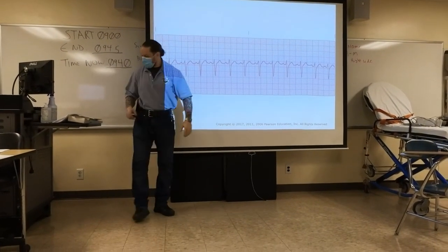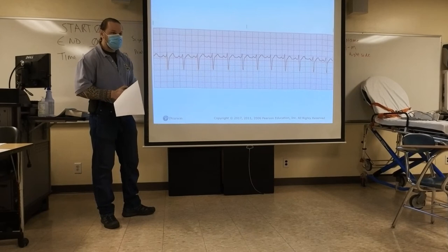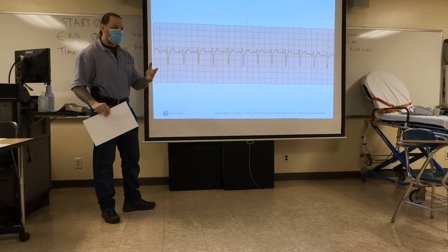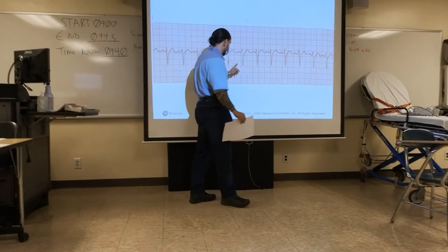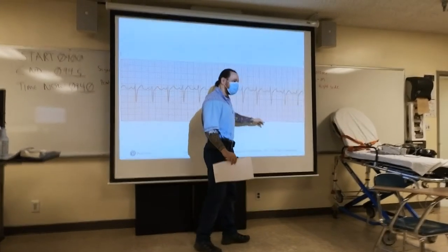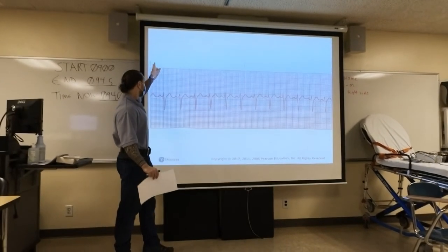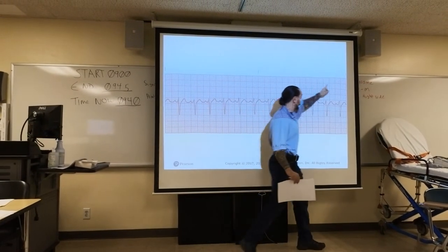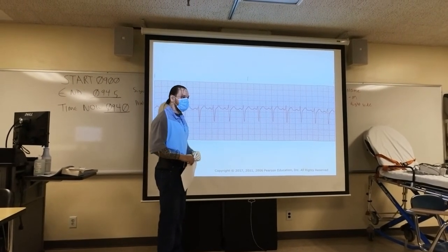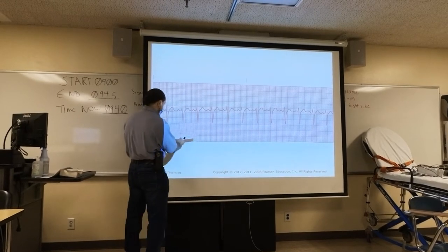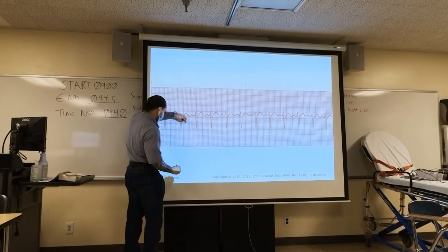I'll show you examples. First, to get the rate on a strip, count the R-waves. Counting across the six-second strip gives 12 R-waves times 10 equals 120. You know it's a six-second strip because of the hash marks on top — from here to here is three seconds, and from here to here is another three seconds, altogether six seconds. Then take a piece of paper, mark off the R-to-R and march it across to check regularity. It seems like they're matching, so the rhythm is regular.